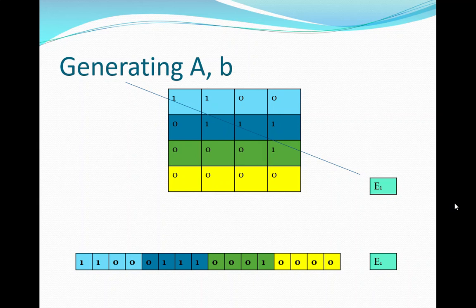You measure an energy differential. The energy detector gives you how much energy is left, and you know how much it started with, so the differential is one minus the other. Then you can calculate, if it lost that much energy, the equivalent length it went through. The U.S. National Institute of Standards, NIST, calibrates this with super high precision.